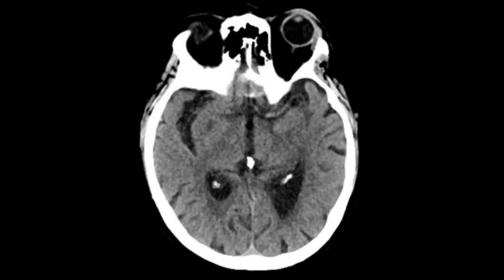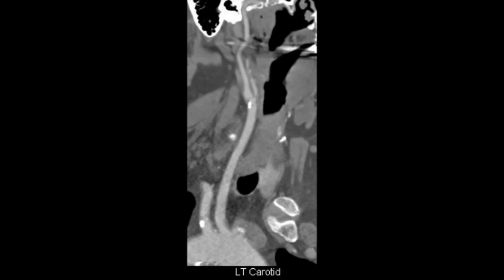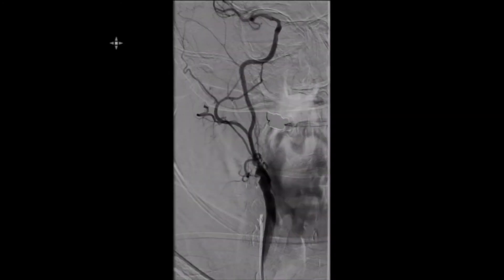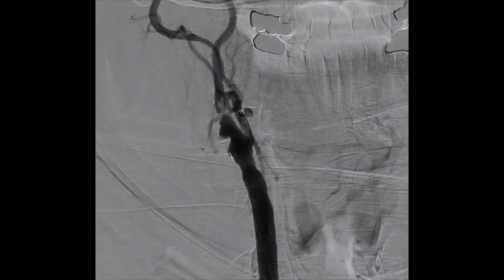A 59-year-old female presented to the emergency department with stroke-like symptoms. CT of the head was negative for any acute lesions. CTA and 3D CTA demonstrates greater than 90% stenosis of the proximal right internal carotid artery. The left internal carotid artery is patent with some degree of calcification at the bifurcation. Injection of the right common carotid artery in AP and lateral views was performed.